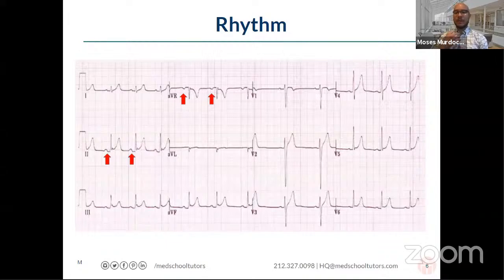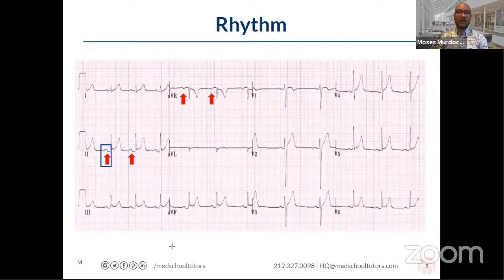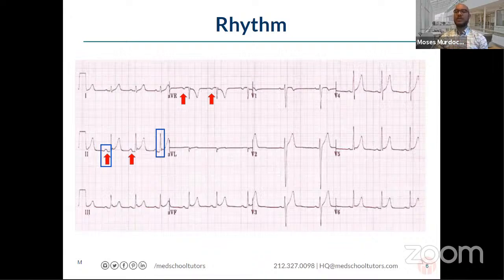What we mean by rhythm is: are the tracings we see on the EKG reflective of normal electrical conduction through the anatomy of the heart as one would expect in a healthy heart? Or are there problems — either from where electrical activity starts or how it moves throughout the heart? It would be useful to briefly review what each component of a typical heartbeat looks like on an EKG. The P waves represent atrial depolarization. Then you have the QRS complex, which represents ventricular depolarization, as electrical signals start in the SA node and travel through the atria.